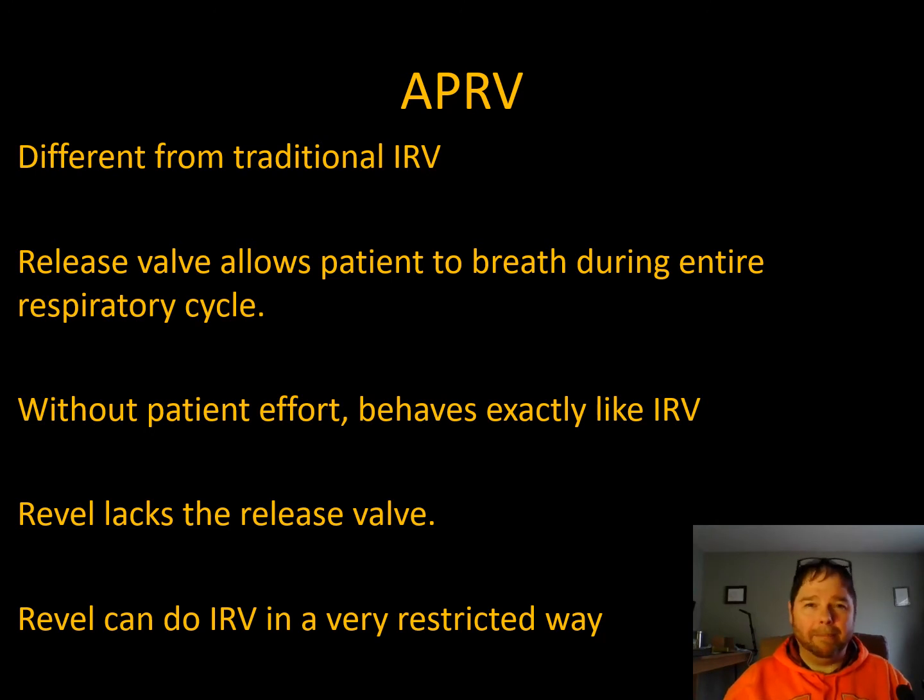That's what kind of makes it like bilevel CPAP. So they'll spend 5 seconds at the high pressure, say of 25, and they can be way higher than that, and they'll spend half a second at the low pressure, which is usually 0, and they are breathing the whole time. So the way the ventilator cycles is asynchronous from the patient. The patient doesn't trigger the ventilator like that. What they do is they can just breathe during that phase, irrespective of what phase the ventilator is in. So that's kind of what makes it like the bilevel CPAP.